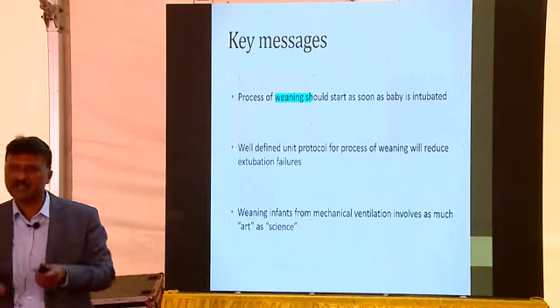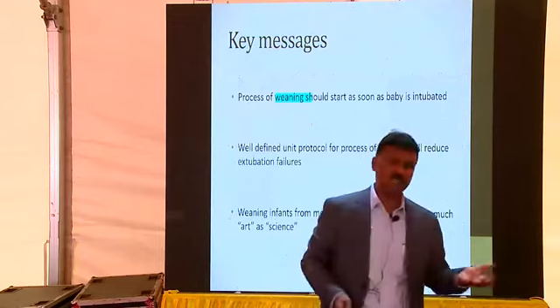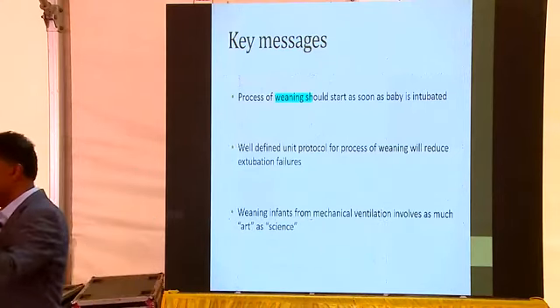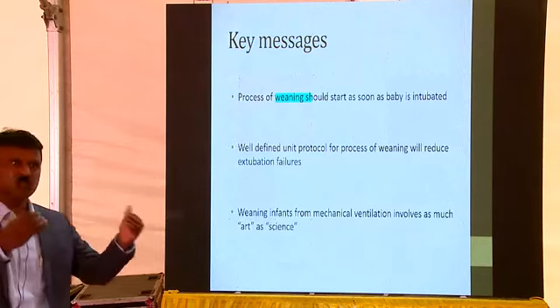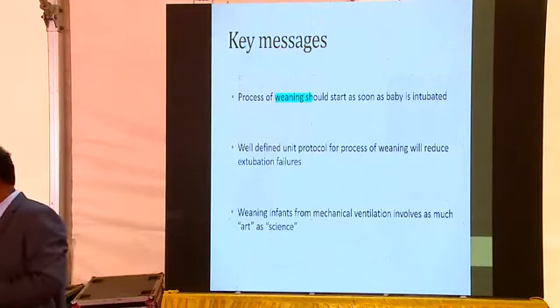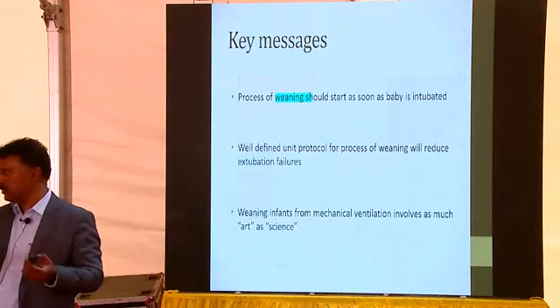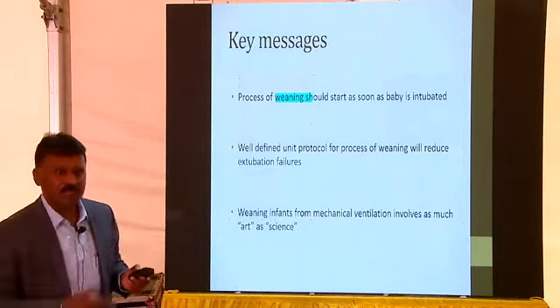Weaning of infants from mechanical ventilation is as much an art as a science. That's what I was trying to tell you. There are a lot of clinical decisions, with pros and cons for each mode or each thing that you do. That's precisely why in teaching ventilation I always say understand the process. SIMV, mode, phase, ventilator, doesn't matter. As long as you understand what is SIMV, what is assist control, what is pressure support.